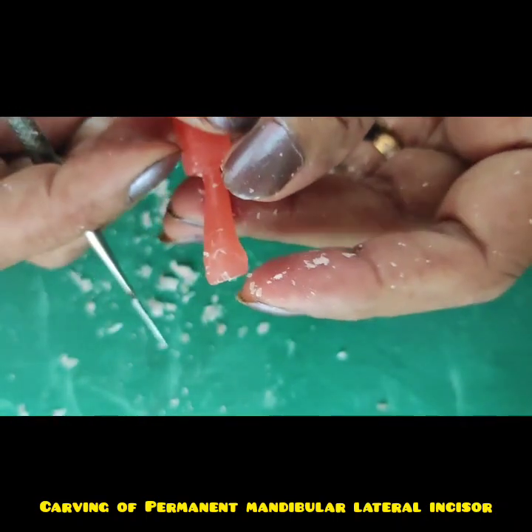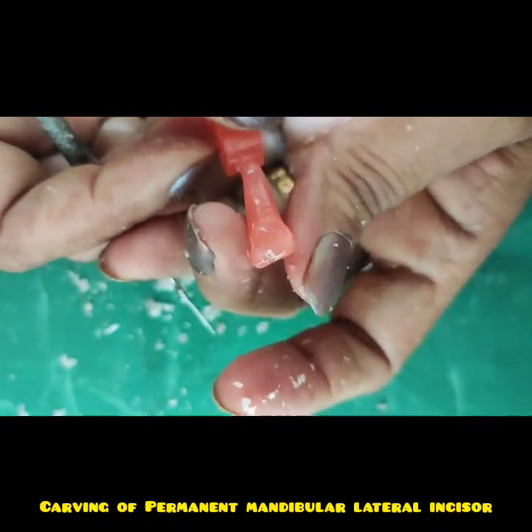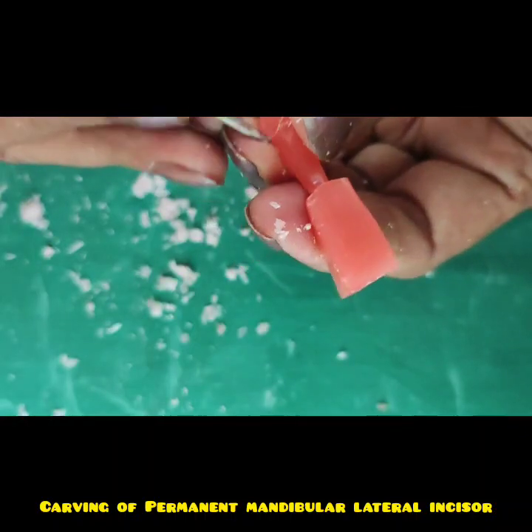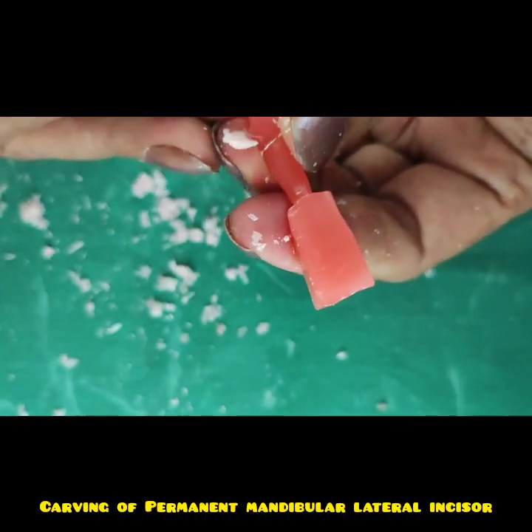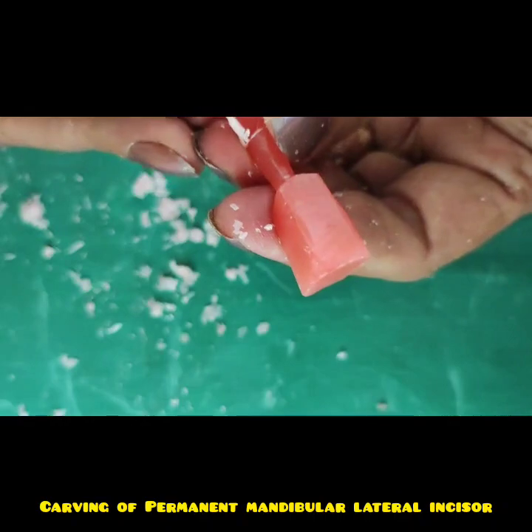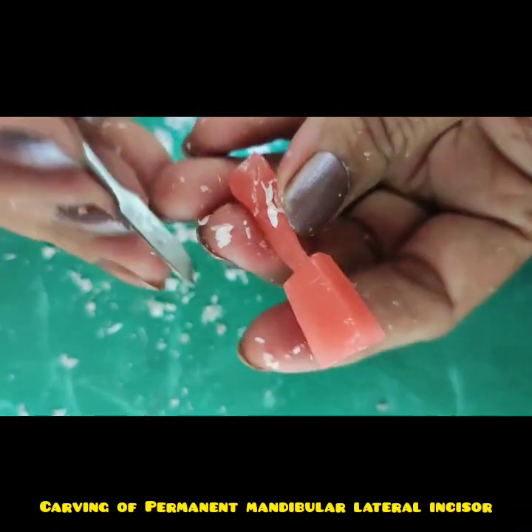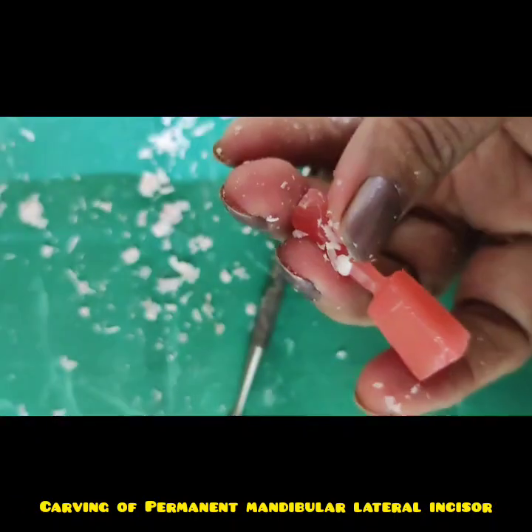So this is my disto-incisal angle, so I will reduce more mesially so that my cingulum is more shifted towards the distal aspect, and after reducing, merge the crown and lingual surface.